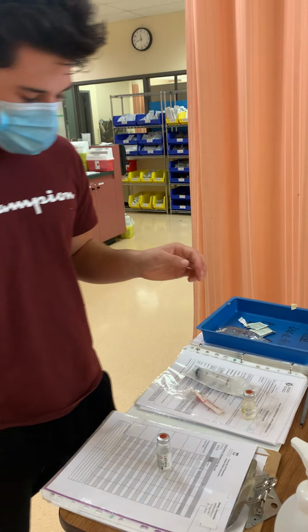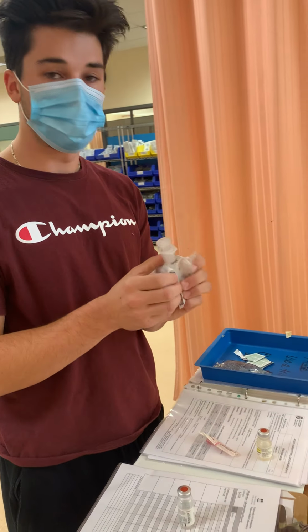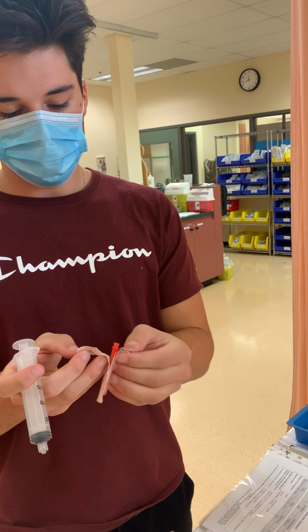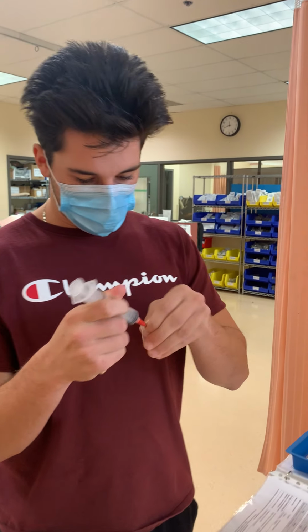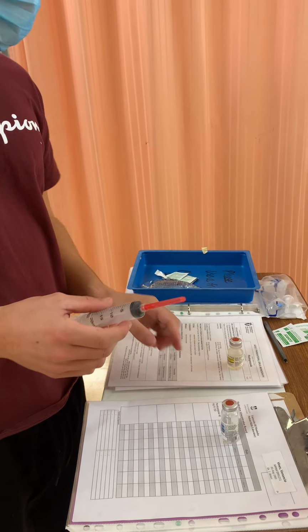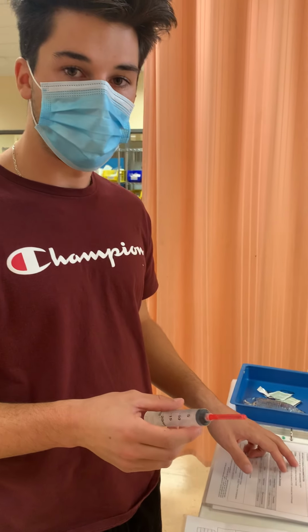After I have now swabbed the tops, I can go ahead and set up my supplies. I'm going to sterilely open both packages for my blunt fill needle and syringe. Again, these are used in labs, so they're not going to be ideal, but I would sterilely open it without touching it, using the butterfly method, and then attach my syringe. Then I can go ahead and pull up my diluent. Again, as per PDM, for a 40 milligram vial, I'm going to add 10 mLs of normal saline.